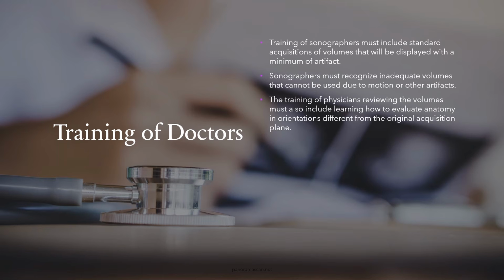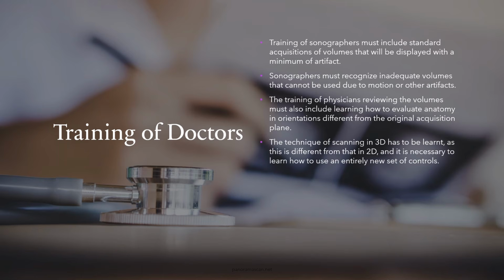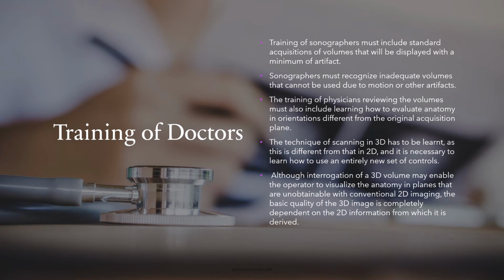Furthermore, physicians must learn the technique of scanning in 3D, as it differs significantly from traditional 2D scanning. They must become familiar with an entirely new set of controls and the specific nuances of working with volumetric data. The training process ensures that physicians are confident in analyzing the 3D data and extracting valuable diagnostic information from it.